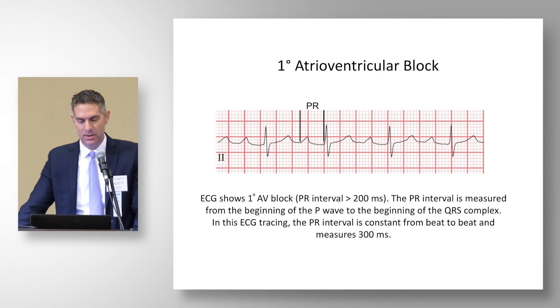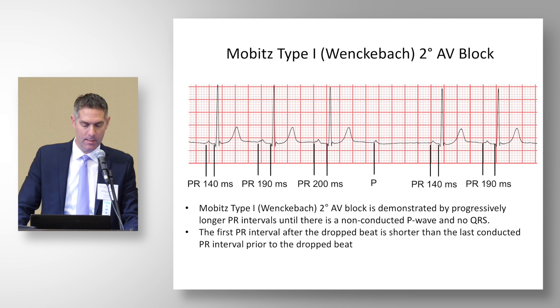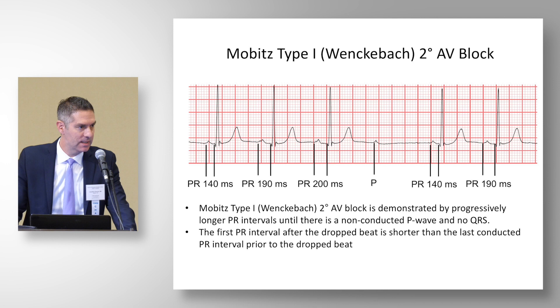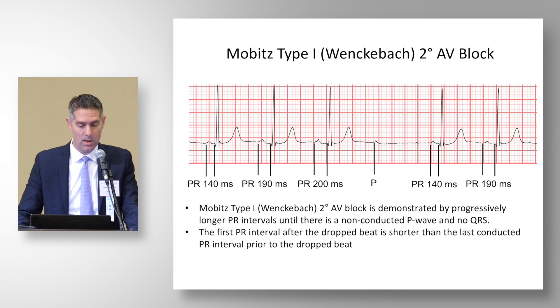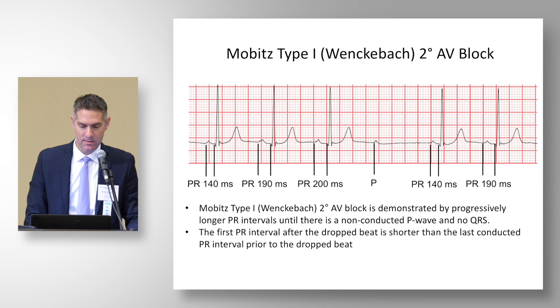This ECG shows Mobitz type 1 or Wenckebach second degree AV block, where there are progressively longer PR intervals until there is a non-conducted P wave and no QRS complex. The initial PR is 140 ms, then 190 ms, then 200 ms, then a dropped beat. Importantly, the PR interval in the next QRS complex is shorter than the last PR interval before the dropped beat — consistent with Mobitz type 1. If you exercise this individual, they go back into sinus rhythm. This is a normal finding on a resting ECG and does not require more investigation.